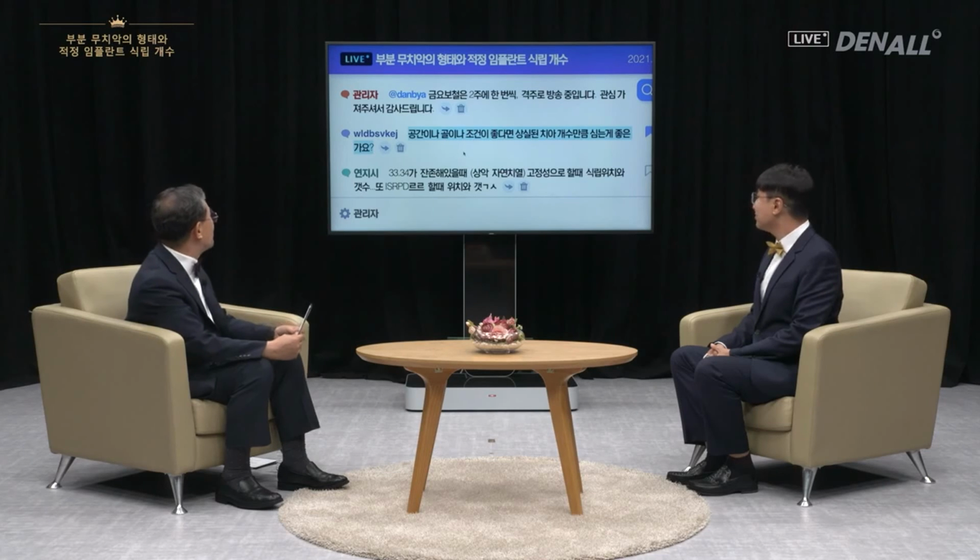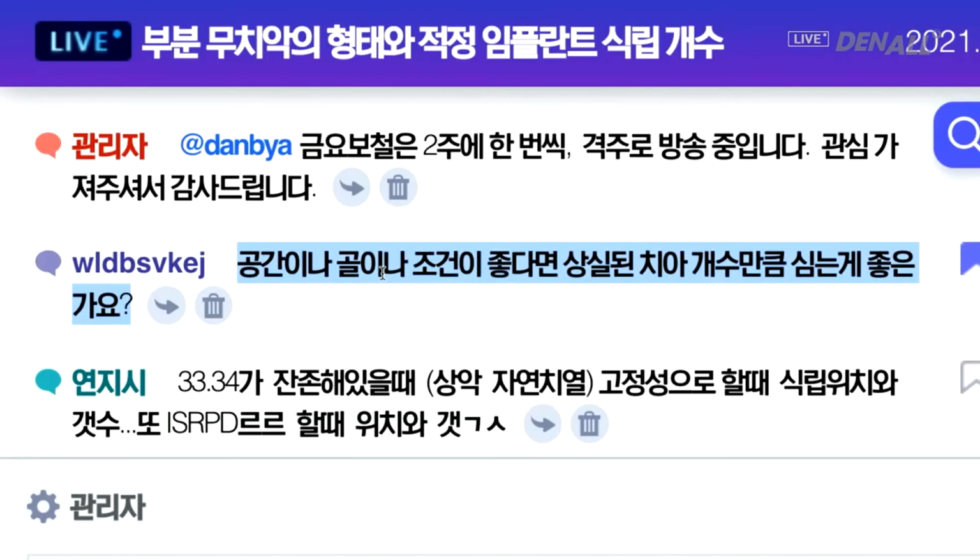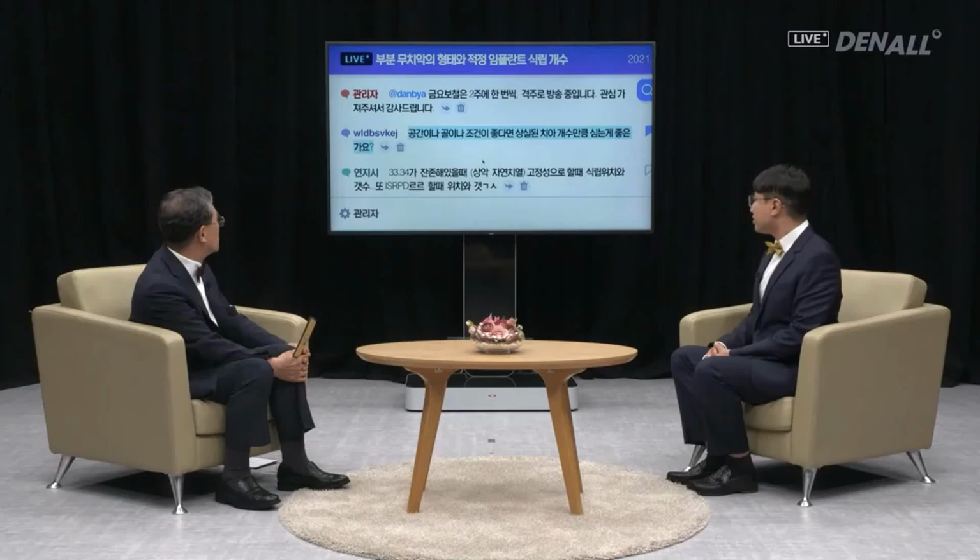I believe we have exhausted all the questions. Are there more questions? Okay, I see. If the space and bone condition is good, can we place as much as missing teeth? In the anterior side, I do not believe so. On the posterior side, that can be.